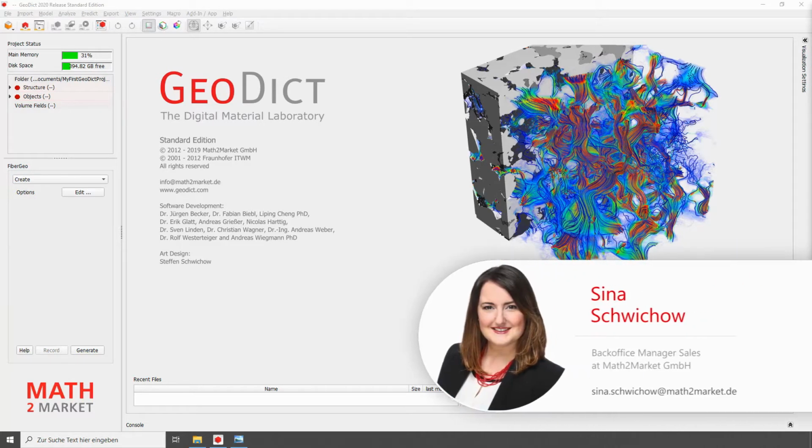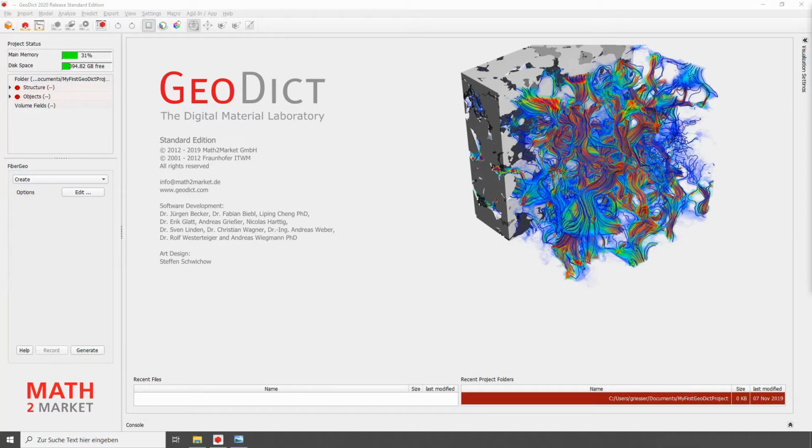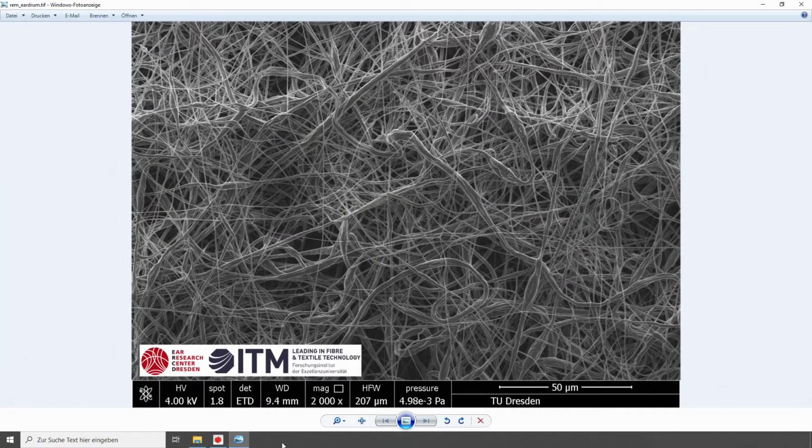My name is Sina Schwichow and I will show you in the following video how to model an artificial eardrum made by electrospinning using our fiber generator module FiberGeo. We would like to thank the Ear Research Center of the University Hospital Dresden and the Institute for Textile Machinery and High Performance Textile Materials of the TU Dresden for providing us with this SEM picture that you see here.